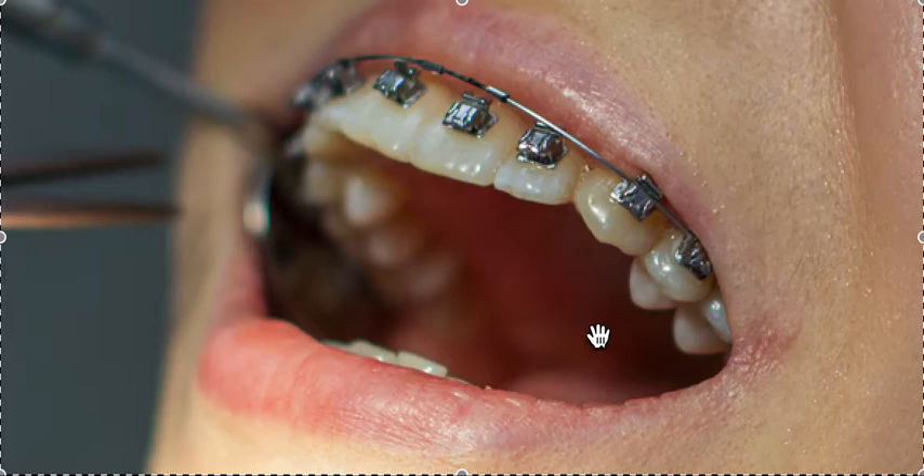If you have a crowding case, self-ligating will save you appointments. In the initial leveling and aligning stage of braces, if you have self-ligating brackets you may only need to come in every two to three months, as opposed to every four to eight weeks with traditional braces. That saves a ton of time. With self-ligating, they can put a slightly bigger wire in and just close the little trap door.